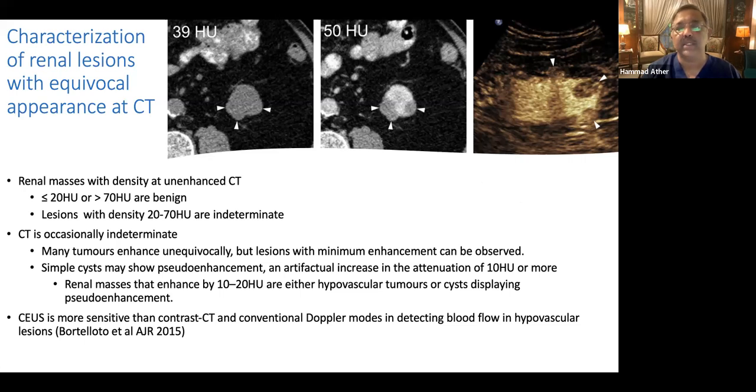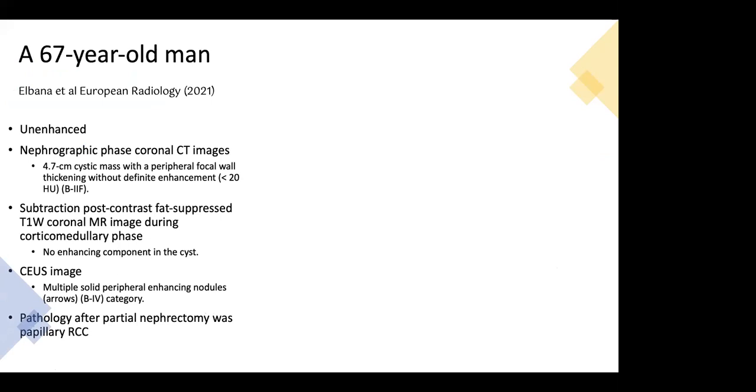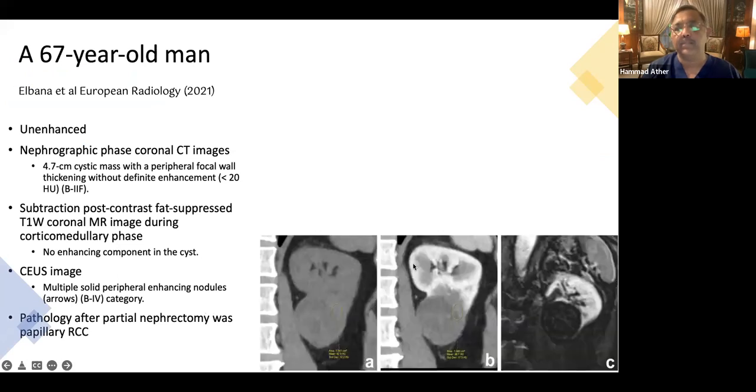Any word on this, Basit? No, I think you have described it well here. Right. So let's take 1 or 2 more cases, and I think we can wrap it up.